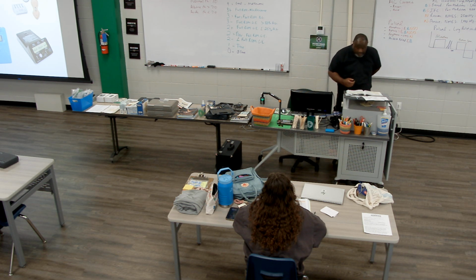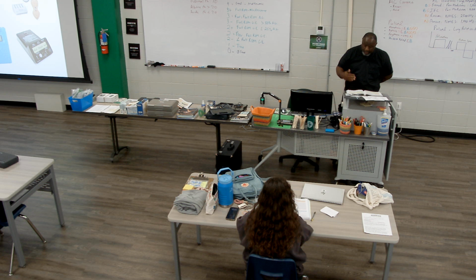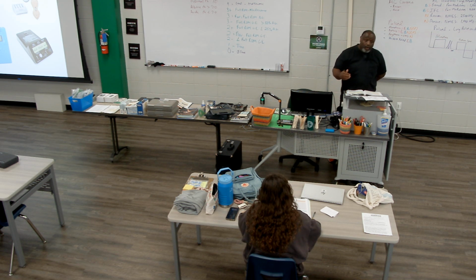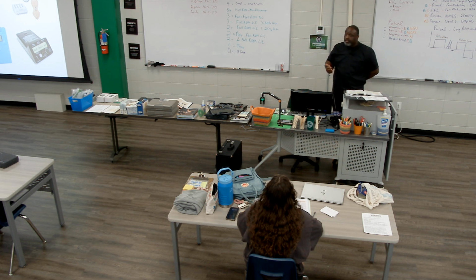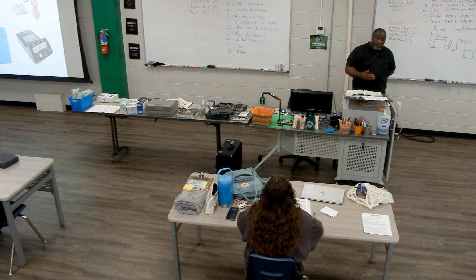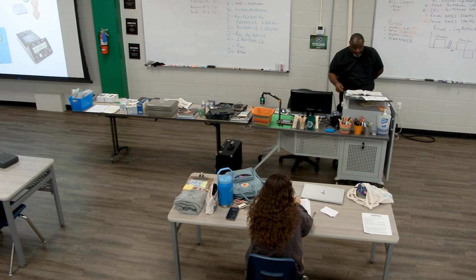So, Ionto power sources. Current Ionto systems are battery dependent, which means they are supplied by DC current, and they will produce DC current. So supply and production: they're supplied by DC and they'll produce DC. I think the big machine back here is one of the few that still has DC, but it's not for iontophoresis. It's for wound care. So it's not designed for this. These units are very specific.